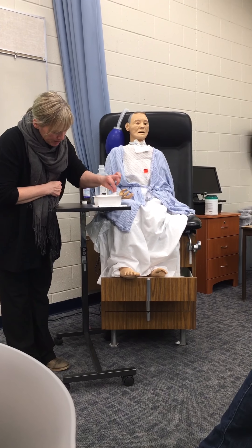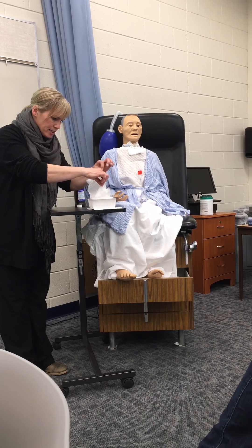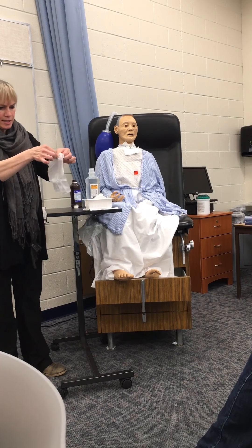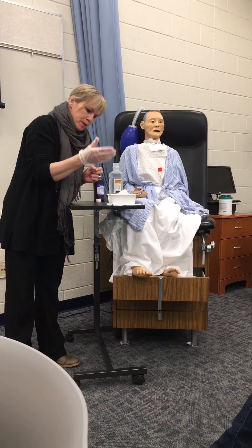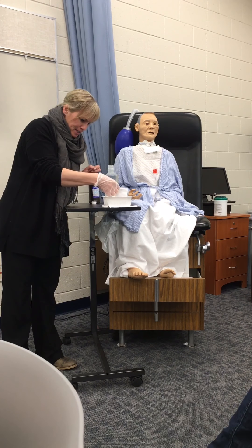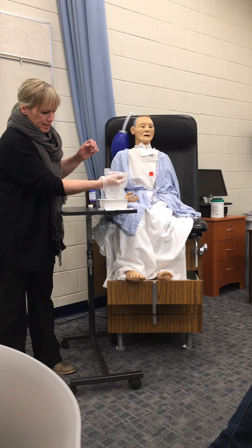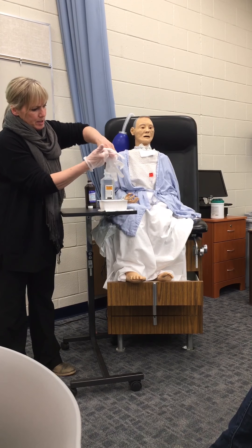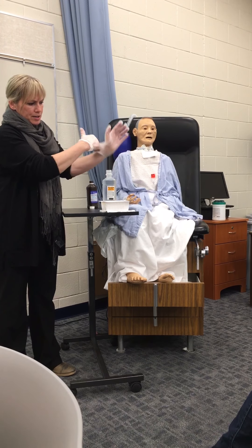So, if I'm going to do this, I'll do my best to say that it was folded correctly so I can legally touch that, but I want to be very careful. It's precarious — a tiniest little cuff here, sticking together. Best advice: have a second pair of gloves. This is sticking together, so you do your best to get your hands under here. Legally, I can touch the inside to open that. And you're pulling away, not toward you — pulling away to allow your hand to move.